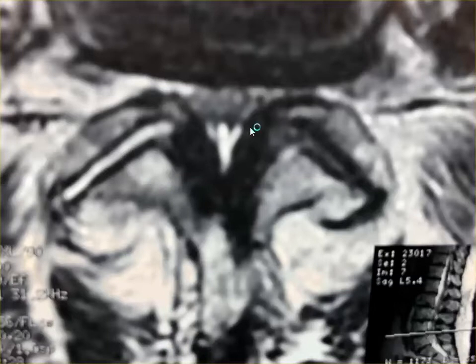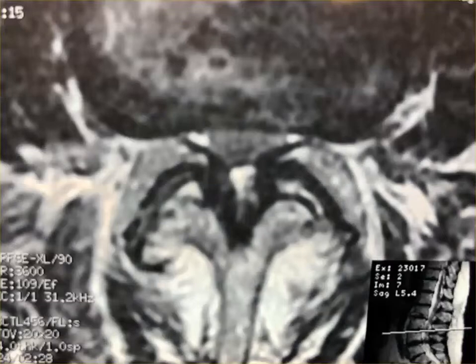And that black stuff? Yeah, ligamentum flavum. That's the same ligamentum flavum that we saw bunched up and round on the sagittal cuts, and you see it here on the axial cuts. And this is 3-4. Next level up, you see very little room for CSF, almost no room for CSF. All the nerve roots are crowded. Hypertrophy of the facets and ligamentum flavum is compressing the thecal sac. So, a very small spinal canal.